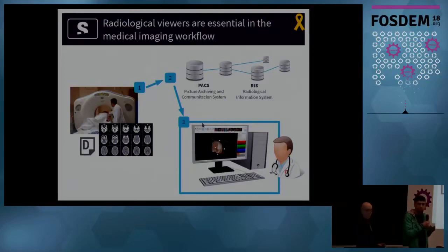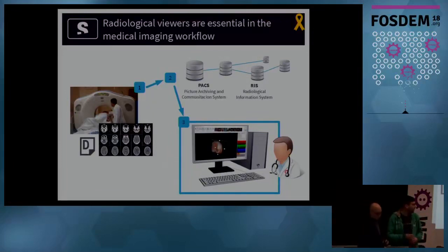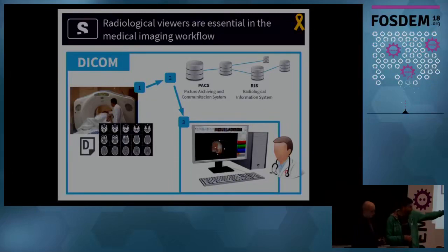Like, for example, the radiologist can retrieve these images from the server and view them in a radiological viewer. Like, for example, Starviewer. The radiological viewer is the part that we develop.